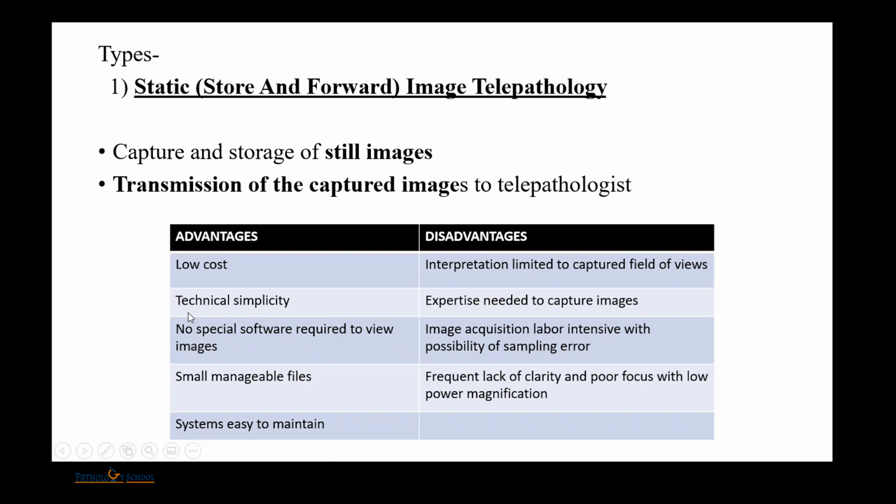The problem with this is that whoever is the referring pathologist should have an idea of what area to capture and send for interpretation. So that's one of the disadvantages. He should have the knowledge and experience to capture it, and the clarity should be good. The advantage is that it is low cost, very simple to use, the files are small and manageable, and the system is easy to maintain.